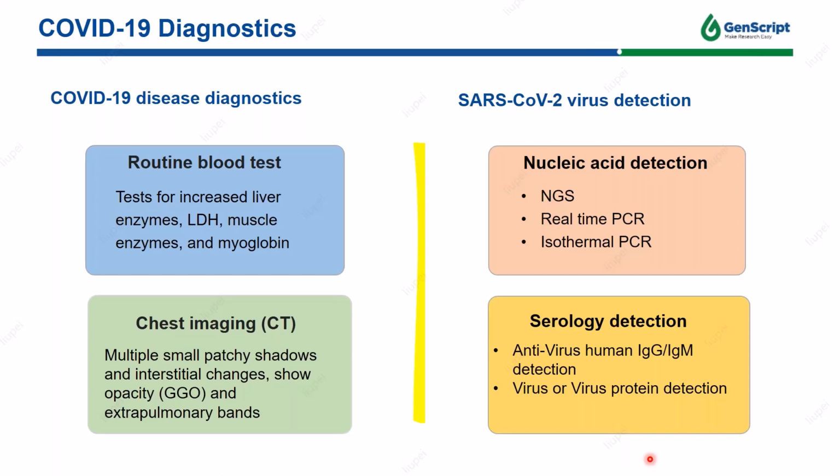An accurate mortality rate of the disease and the level of herd immunity in the population can be determined from the results of this test. Virus protein detection is also a method to monitor the infection state.